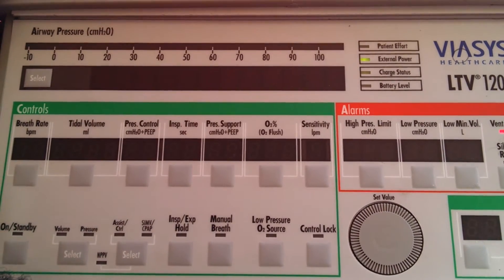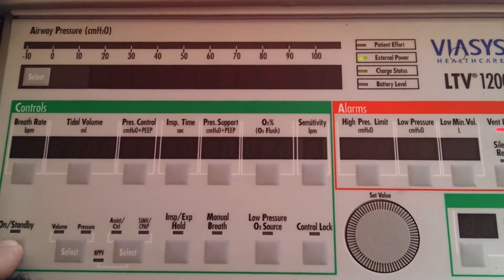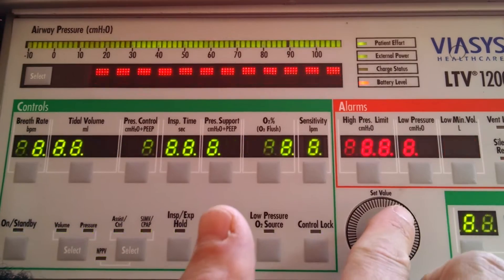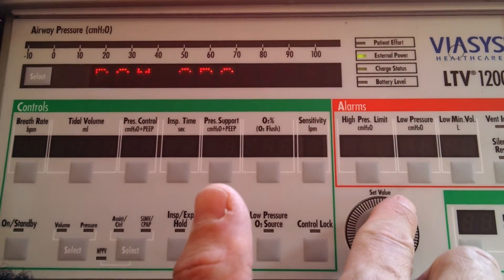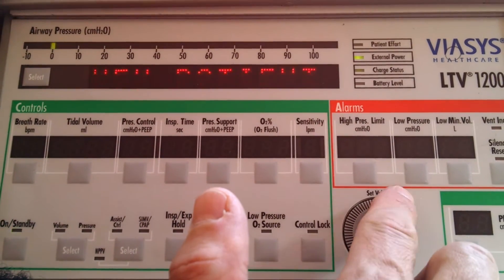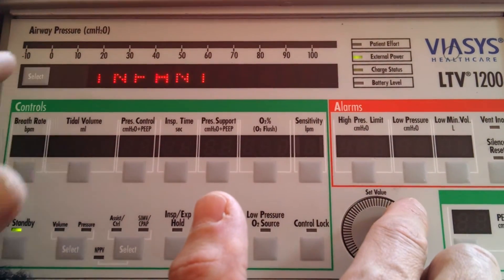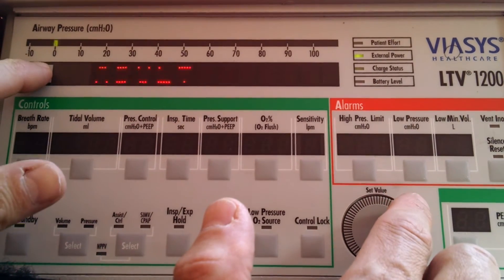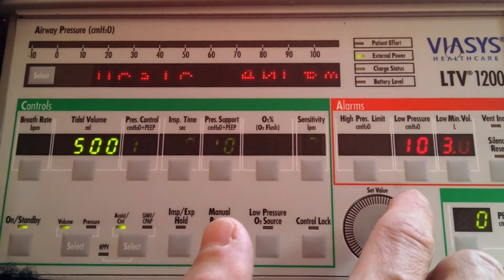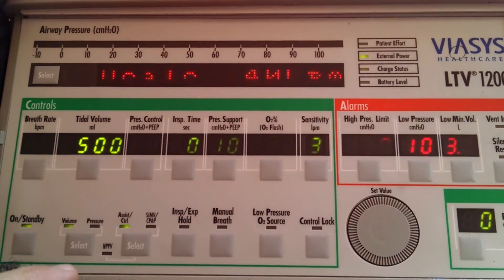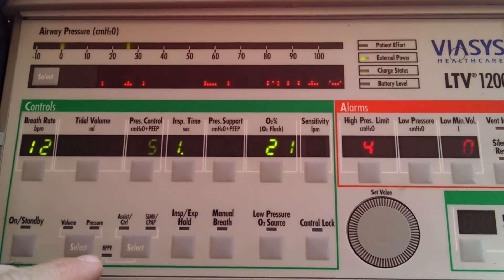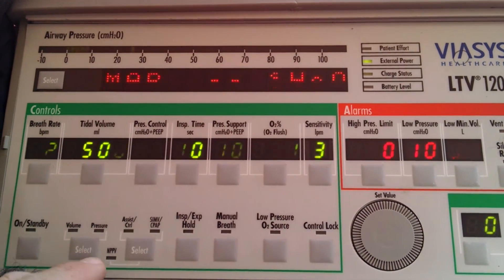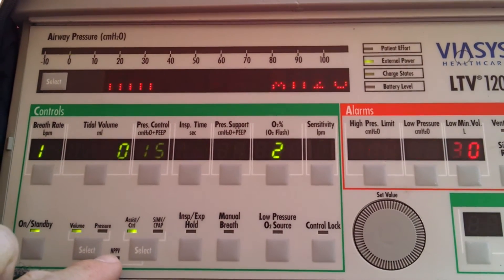Initially what we're going to do is start the ventilator same as usual - turn it on, select new patient when it comes up, select adult, because typically we're going to be doing this on an adult patient. Now we're going to come down here where you see Assist Control, SIMV CPAP, and the NPPV.